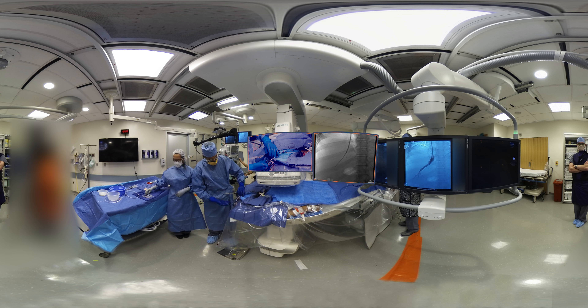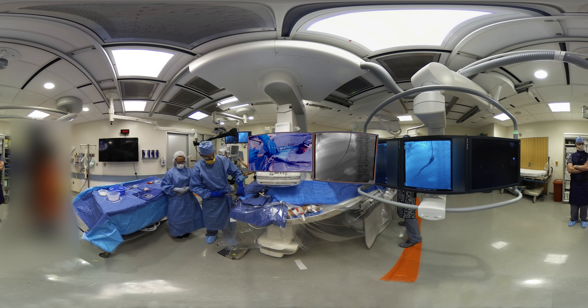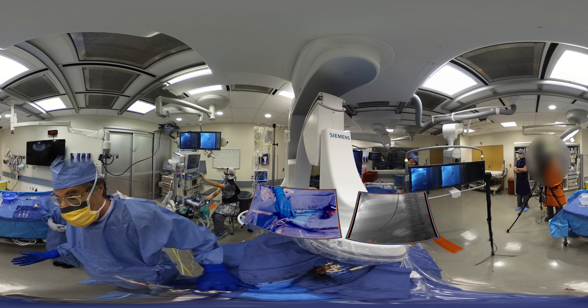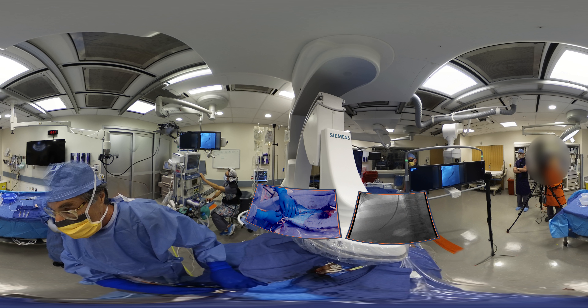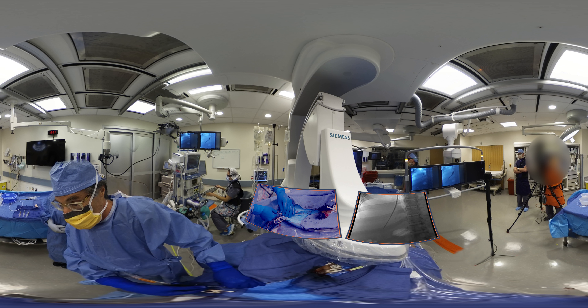At this point I can control the entirety of the system with one hand, leaving me free to screw the syringe on or off the needle assembly without having it rotate and losing ground. That's essential in puncturing any small portal vein and even moving with the patient with respiration, trying to keep the needle in place. Very important to have each hand essentially controlling needle position and rotation. At this point we can now bring the apparatus back and prepare for our puncture.